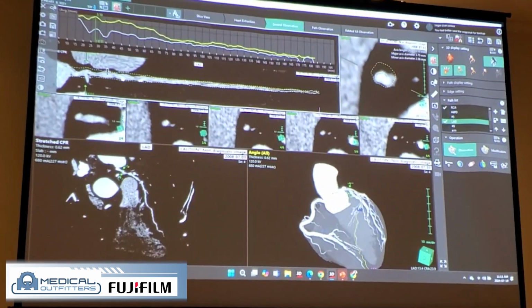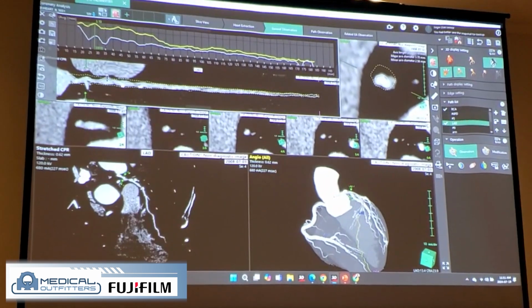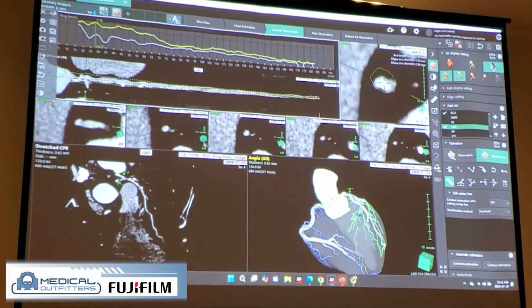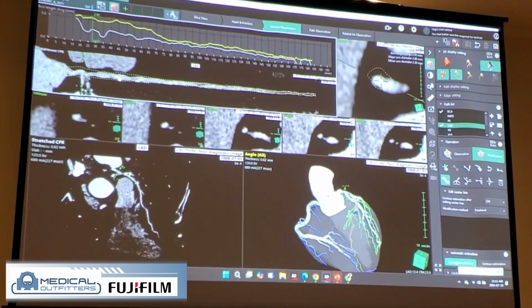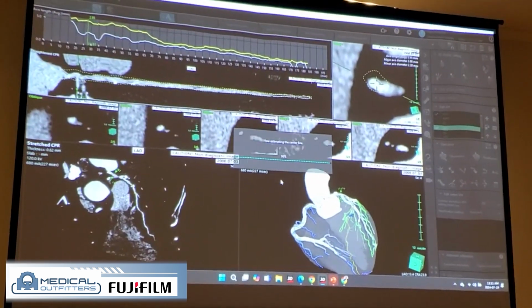If you wondered about this spot right here, that's one of the places where, anytime you have a little bit of beat of the heart, you might get a little bit of motion and it might pull the center line off from center just a little bit. So you would just go in and modify that a little bit. It gives you a little pencil. I would say, no, no, no, it comes up here like that, and then ask the system to re-identify it.